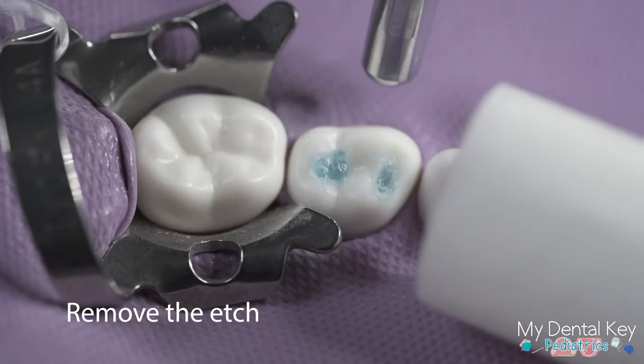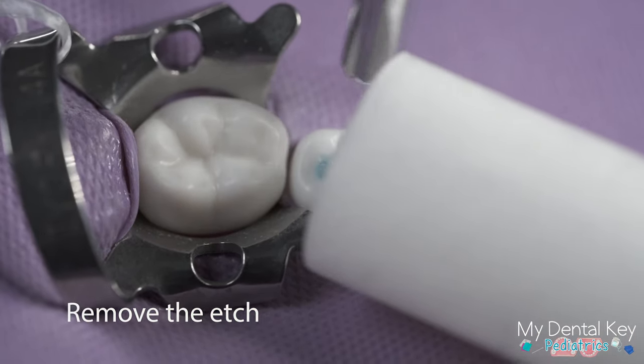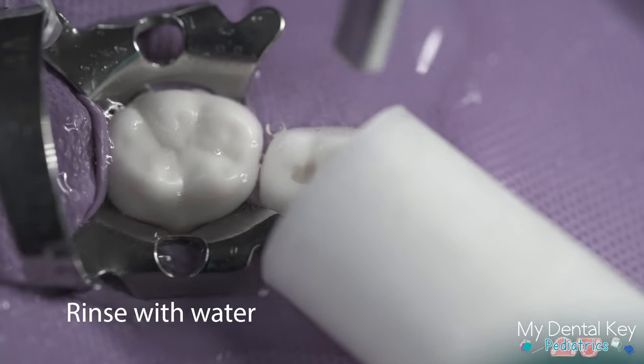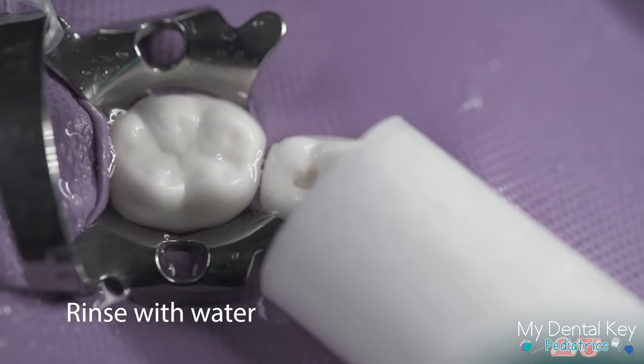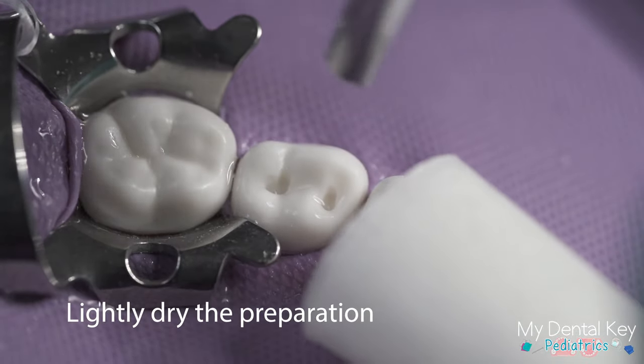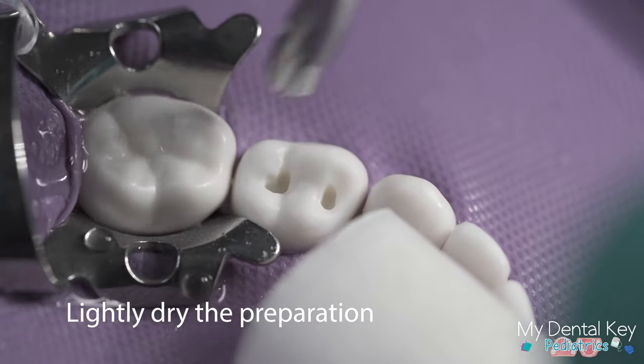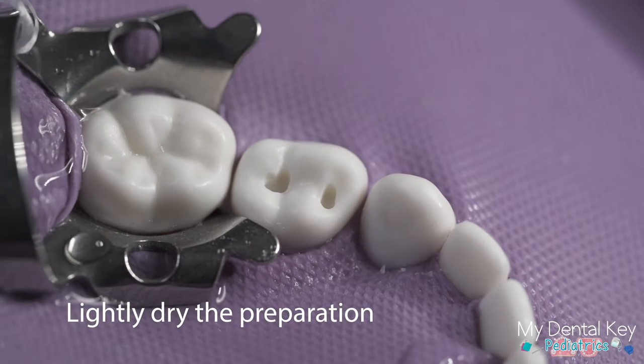Use the high-speed suction to remove the majority of the etching, then rinse the preparation with water for 30 seconds. Dry the preparation using the air water syringe in the clinical setting. After lightly drying, the enamel should appear frosty and the dentin will be slightly moist.